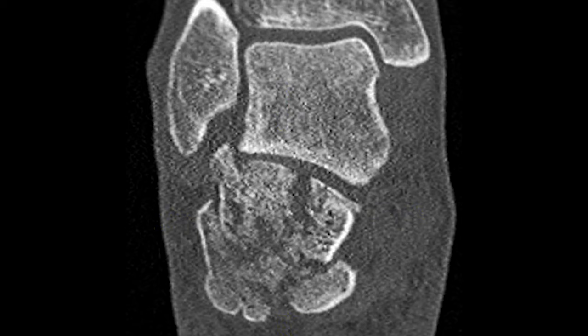According to the Sanders classification, this is a type 3 fracture. You can see two fracture lines on the coronal CT scan — these lines are in the A and B zones, so this is a Sanders 3AB fracture.